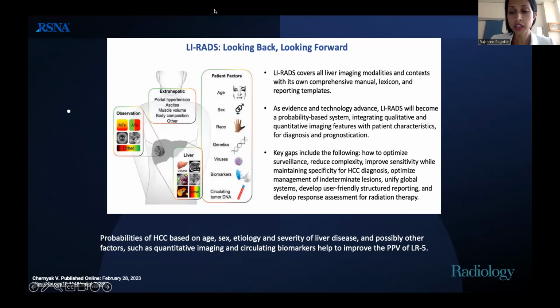So you cannot compare the two here. And if I understand the question properly, the question is about comparing Hounsfield units on the triple phase CT versus on the MRI. Can you quantify it with a number, or can you actually measure it on the MRI, or is it just a subjective thing?